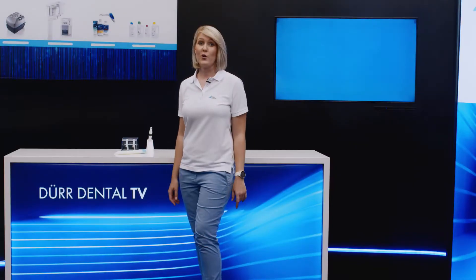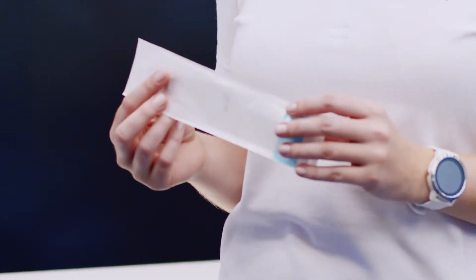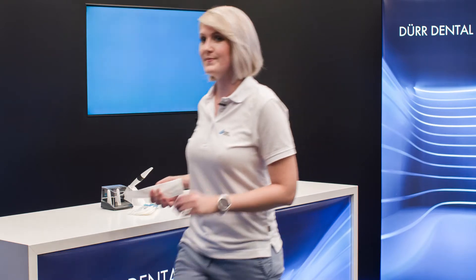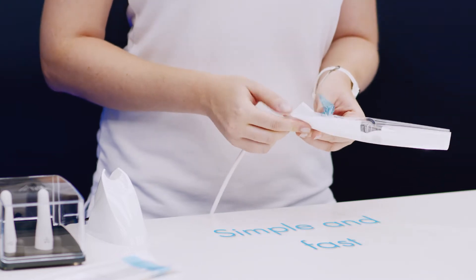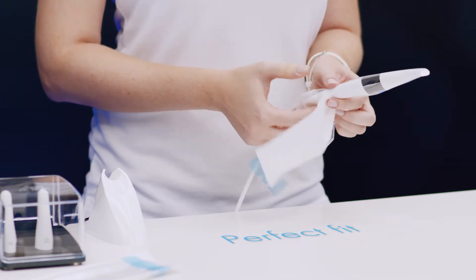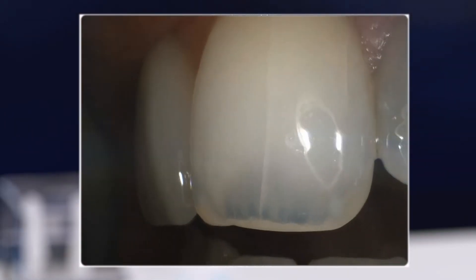Right now hygiene is more important than ever before. The Vistacam iX-HD Smart comes with hygienic protective covers that fit perfectly and protect against cross-contamination. These hygienic protective covers do not affect image quality.